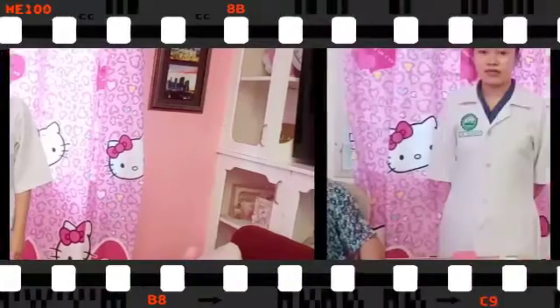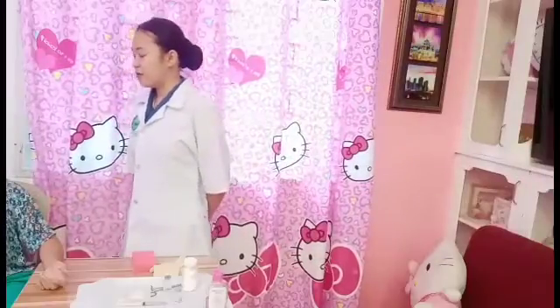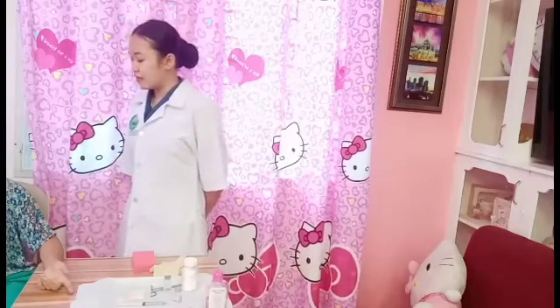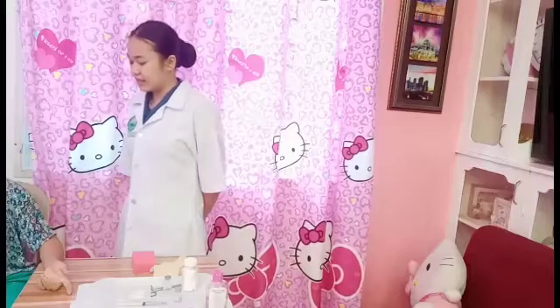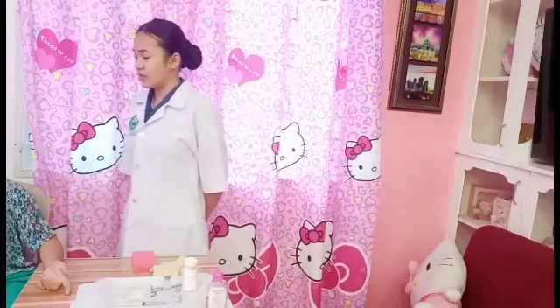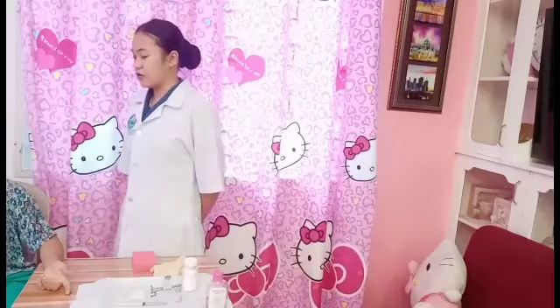Next is to prepare the client and explain to the client that the medication will produce a small wheal or bleb to facilitate acceptance and compliance to the therapy. Good morning po, ma'am. Ako po si Perlini Pabroques, isang student nurse, at gagawin po natin ngayon ay skin testing kung saan magtuturok po ako sa inyo ng gamot at magkakaroon po ito ng konting bukol pero ito po ay normal po lamang.